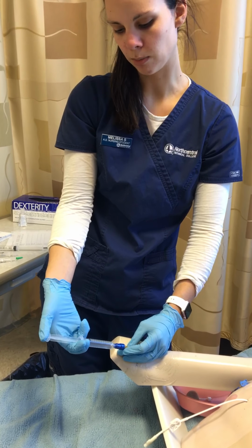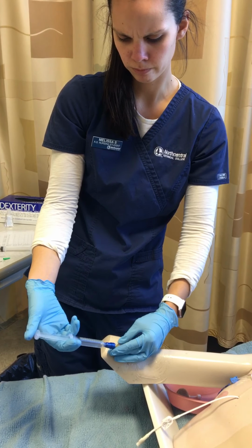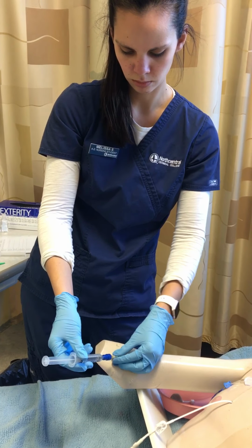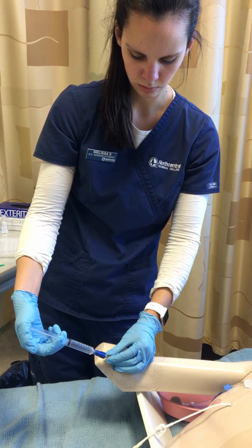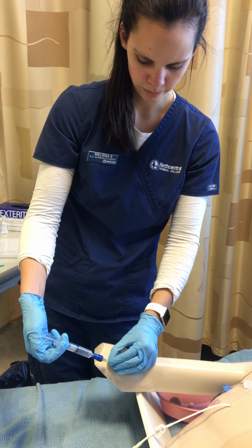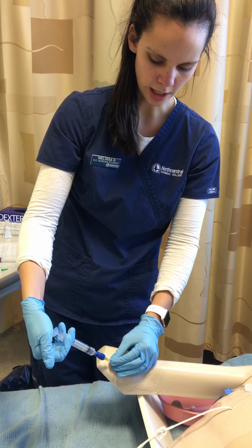I'll unclamp it and give 5 milliliters at the same rate as my med. Alright, so that was 5 minutes, and then for the last 5 milliliters, I'll do a pulse technique to really flush the line.